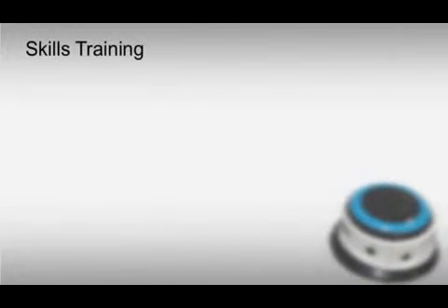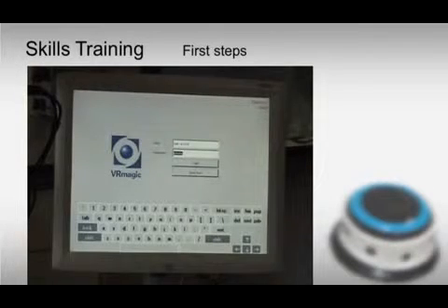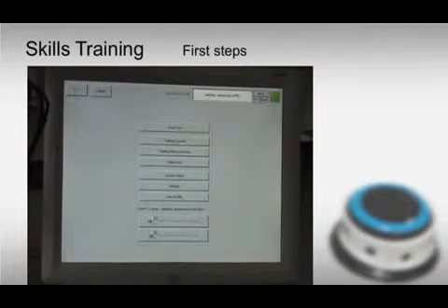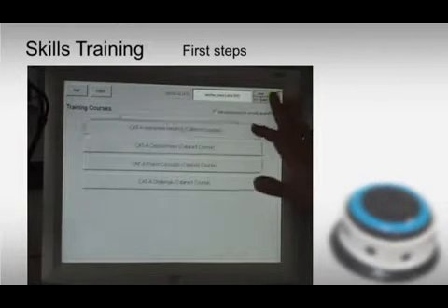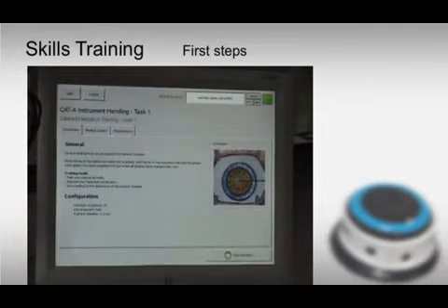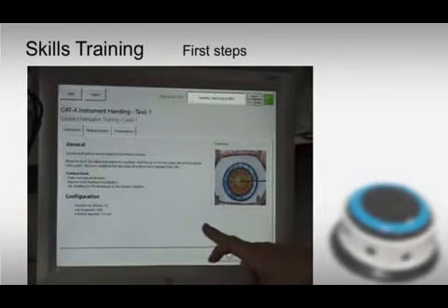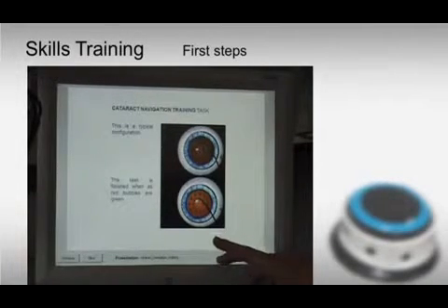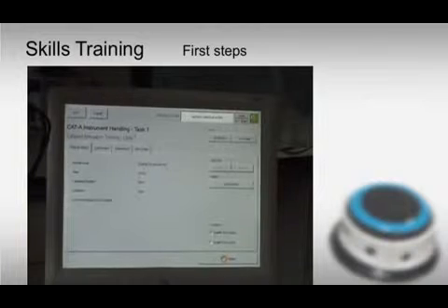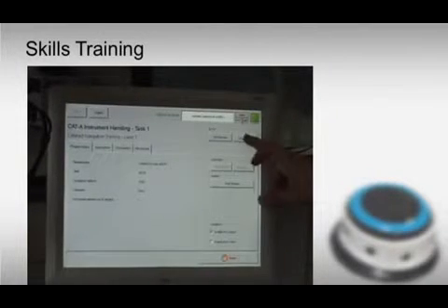To start the program, every user must work with their own ID and password. The software starts with an overview of the device's functions. The different training levels provide individual explanations advising how to perform the task. A second person can follow the training using the live image mode. In the first course, instrument handling is trained.